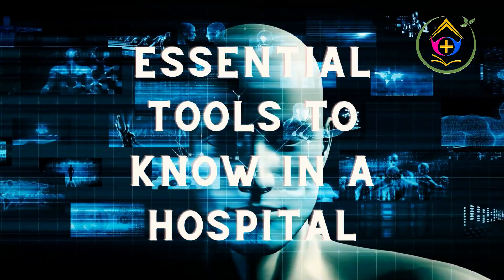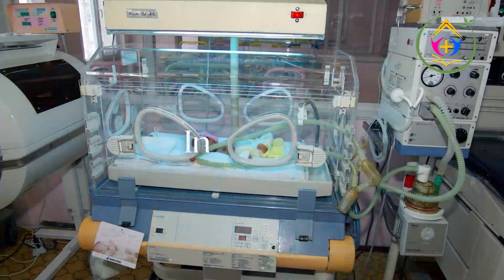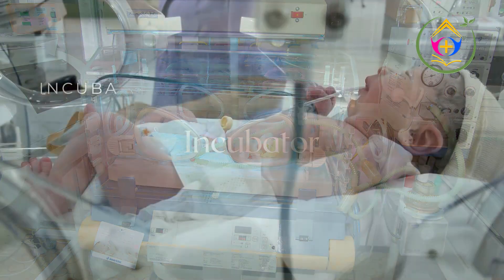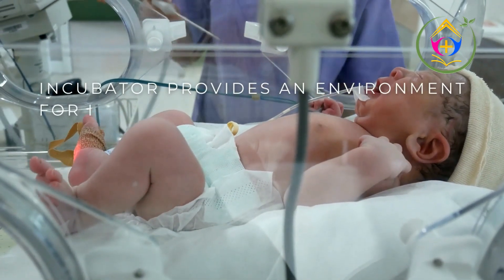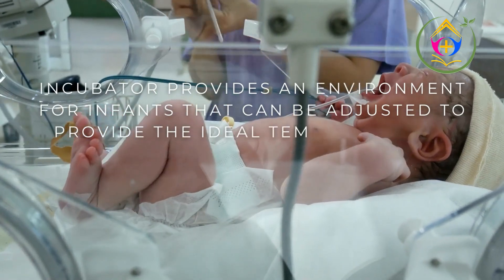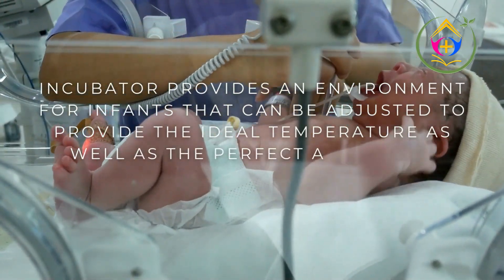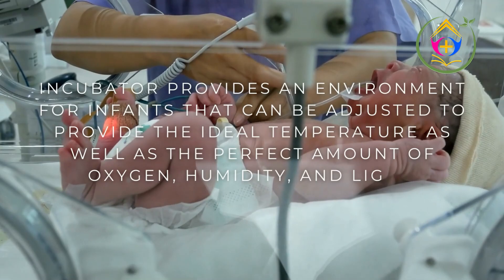Essential Tools to Know in a Hospital. Incubator: provides an environment for infants that can be adjusted to provide the ideal temperature as well as the perfect amount of oxygen, humidity, and light.